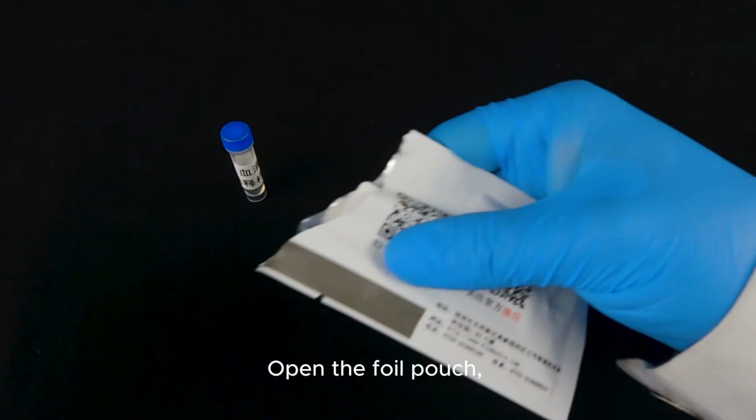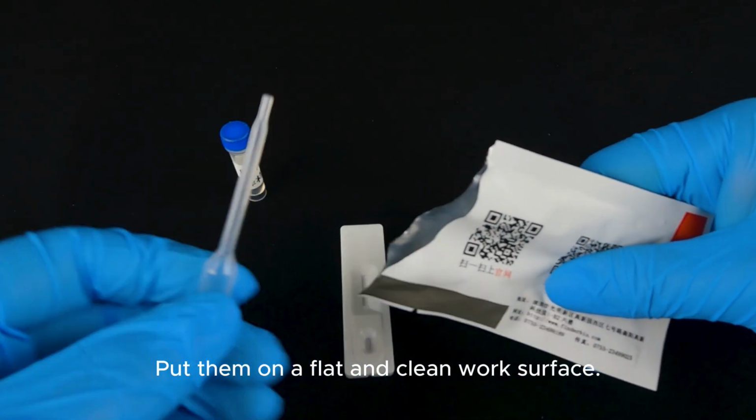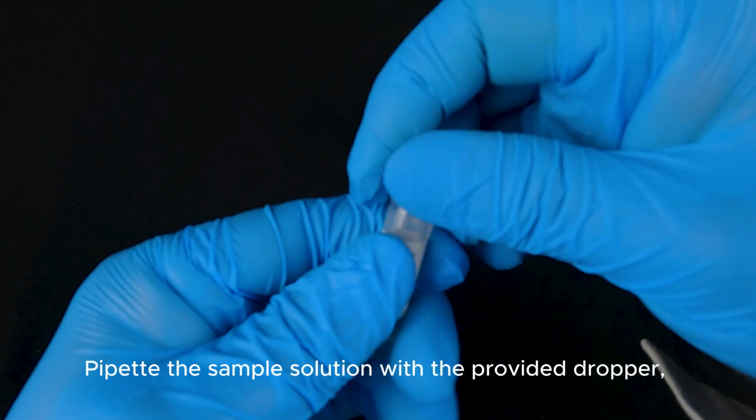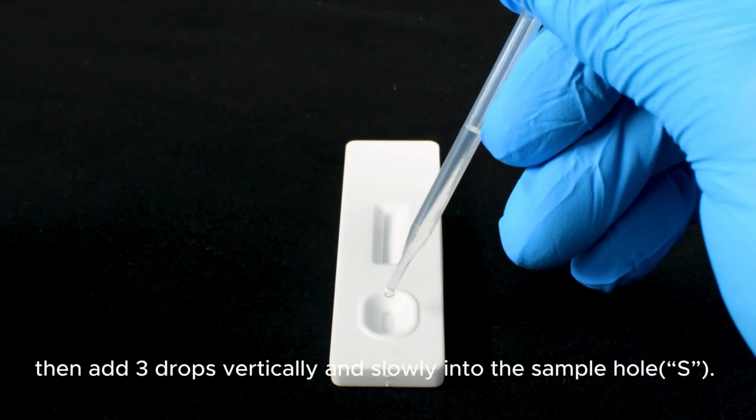Open the foil pouch, take out the test card and the disposable dropper. Put them on a flat and clean work surface. Pipette the sample solution with the provided dropper, then add 3 drops vertically and slowly into the sample hole.